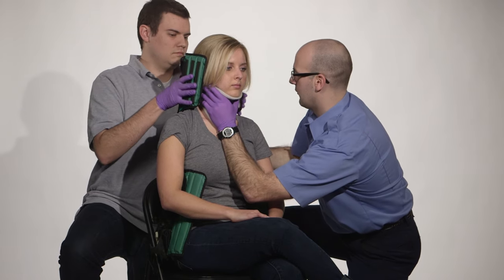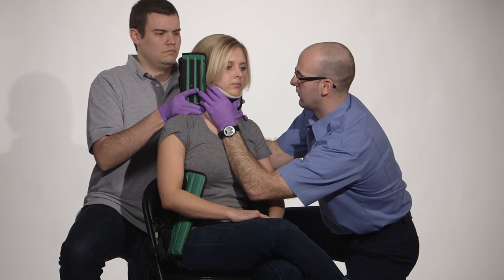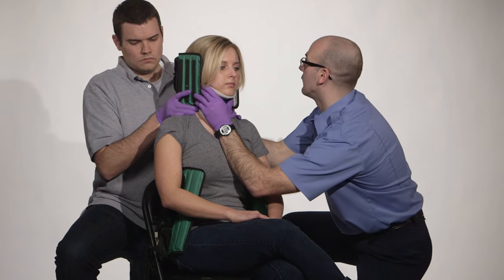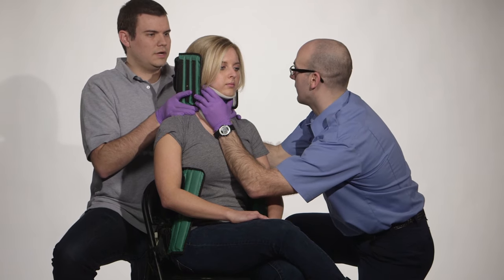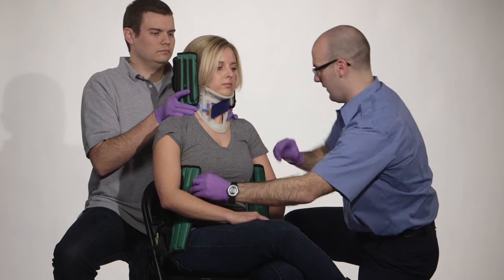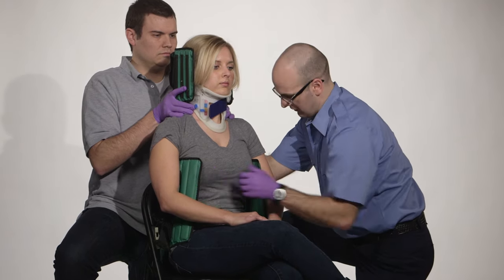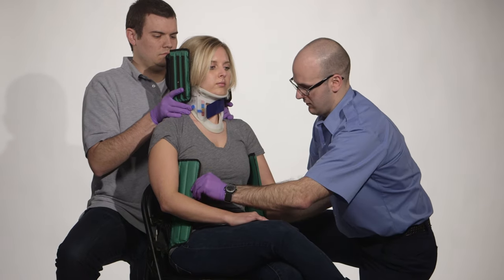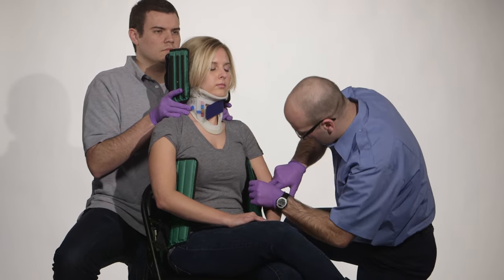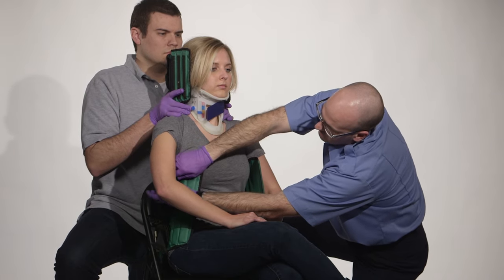We have that now. On three, we're going to sit you back into the chair. One, two, three. Now I'm going to turn C-spine back over to you. I will make sure that the device is positioned how I want it. Starting on the torso, I'm going to secure the device to the patient.